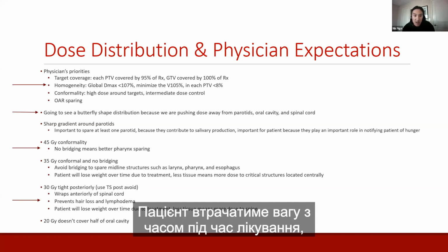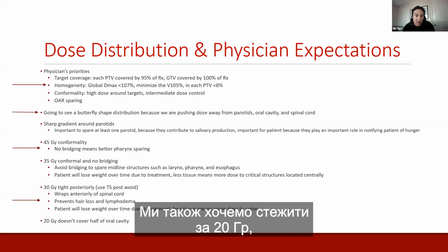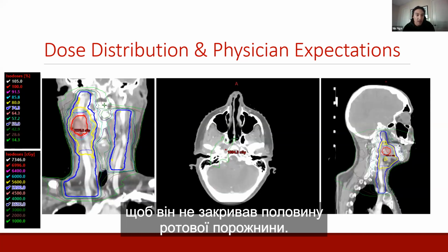The patient will lose weight over time during the treatment, putting more dose in that area. We also want to keep an eye on the 20 gray so it doesn't cover half of the oral cavity.